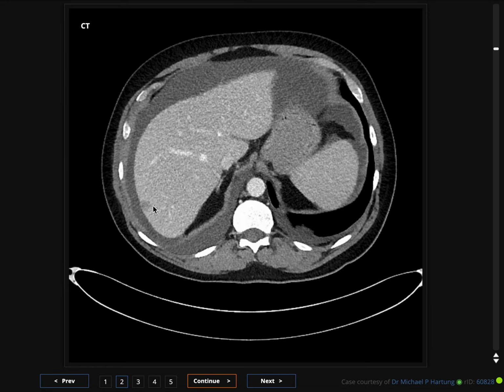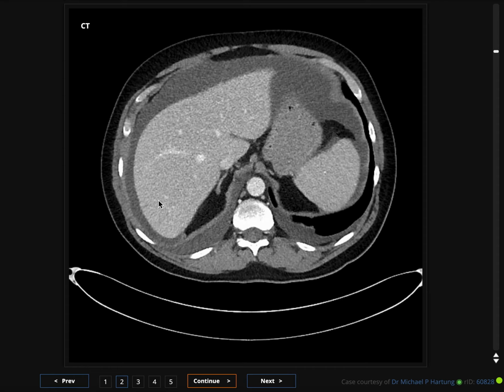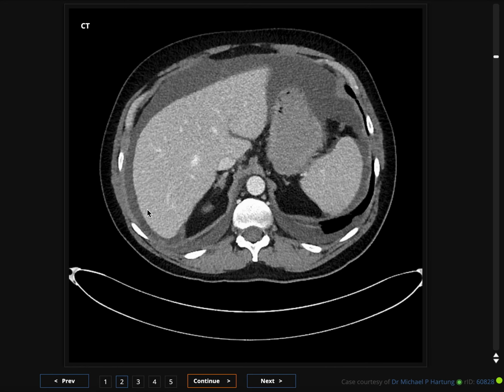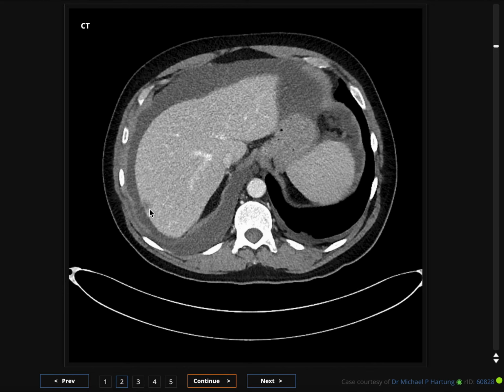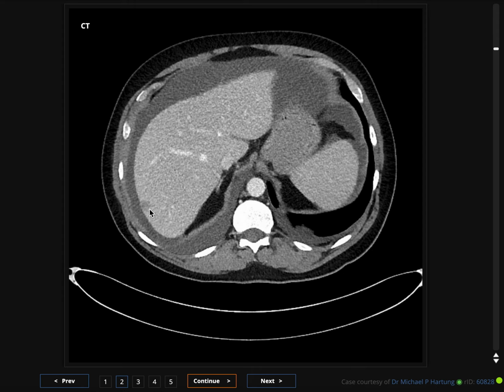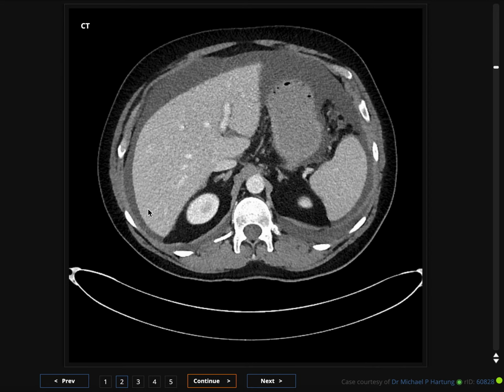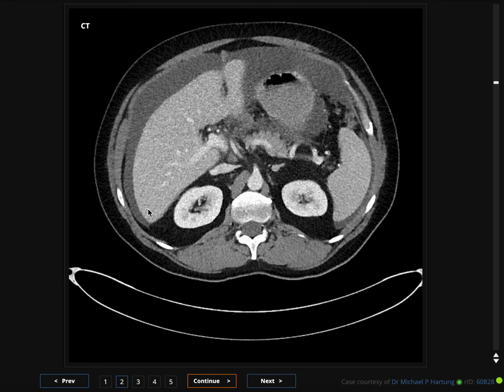As I go down to the level of the liver, there is ascites all around the liver, around the spleen as well, and I also see this hypodense lesion in the liver. Now, these hypodense lesions are always indeterminate. If this was a young, healthy person and if this was all I was seeing with no history of malignancy, I may be tempted to just call this a probable hemangioma and not recommend any follow-up, but anytime someone is around 40, 50, then you have to think, could this be a metastasis.